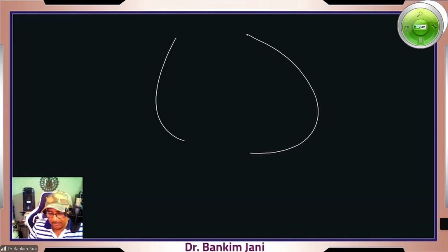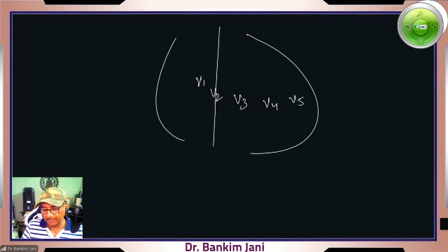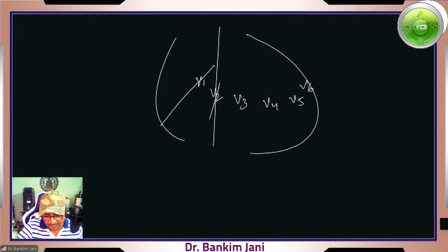Now next, this is the heart. And we said that for the chest leads, this is the central line, and it starts from here. V1, then V2, then V3, then V4, then V5, then V6. By V5 and V6, they go quite lateral. But these are the leads which are like the Z-axis. So we have to really draw it like this.